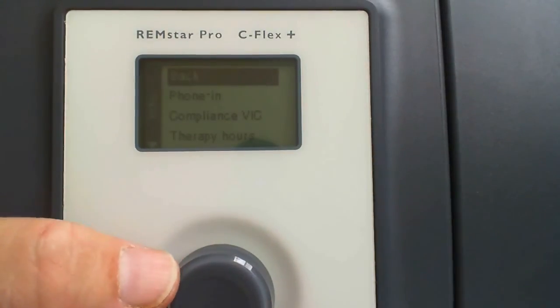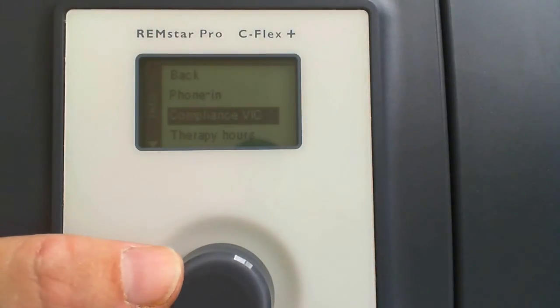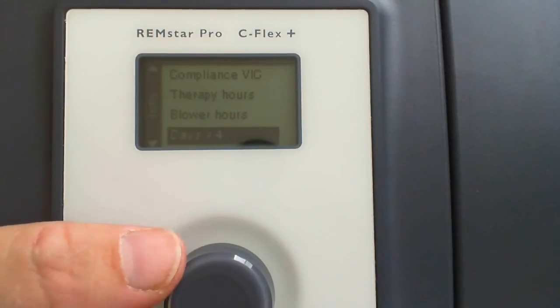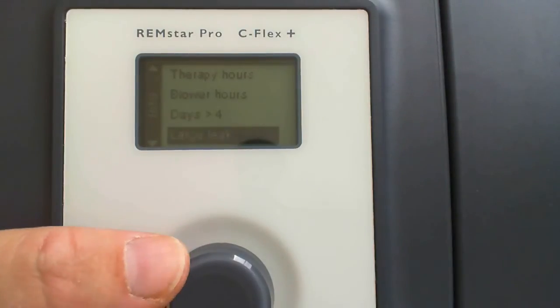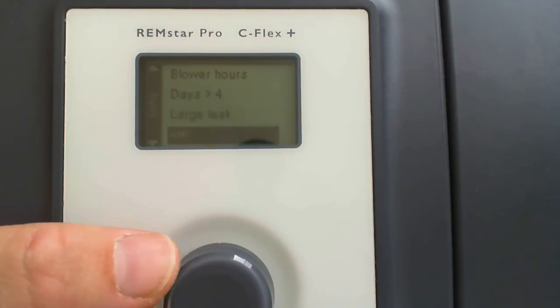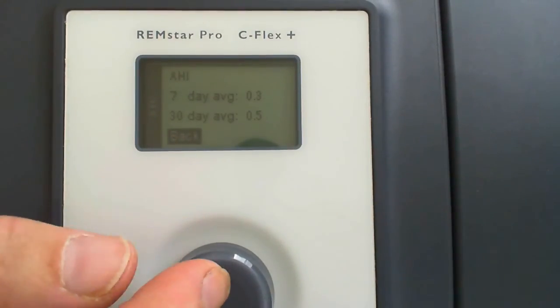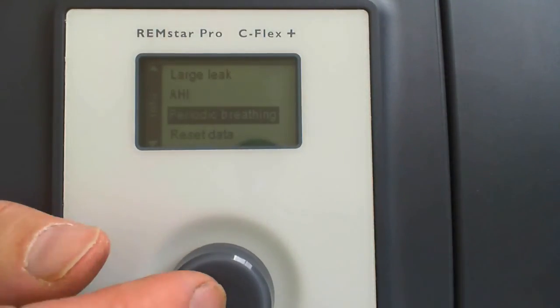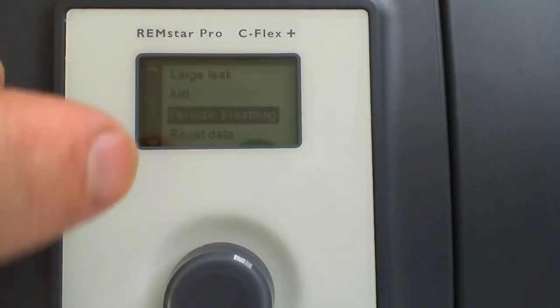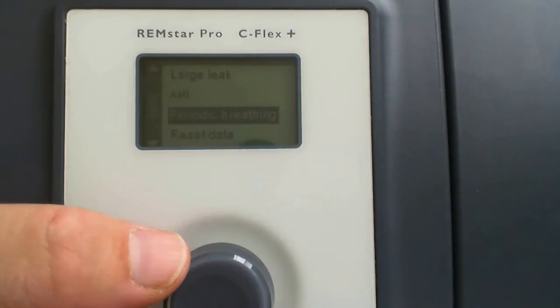Now, the info section, there's a lot of duplication in here. So phone in is the same, VIC compliance is the same, therapy hours is going to be the same. Here we have blower hours, that's the same. Days over 4, that's all the same. Large leak, that's the same reporting. There's your AHI number. There's another menu that will allow you to turn that on and off. I think that's in the setup, actually. So this is just another place to report that. There's your periodic breathing. All this information is really the same.